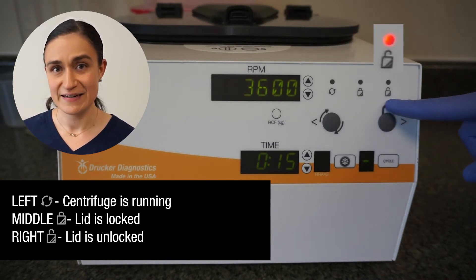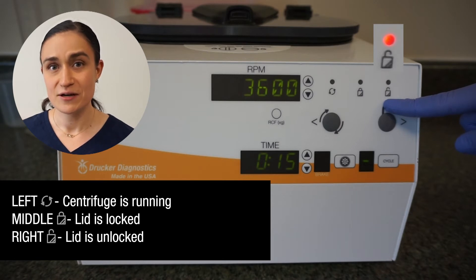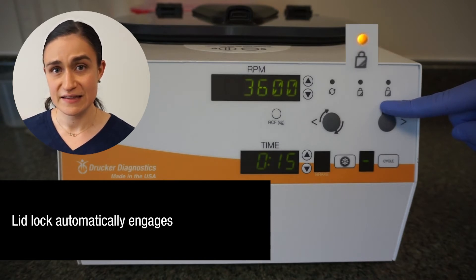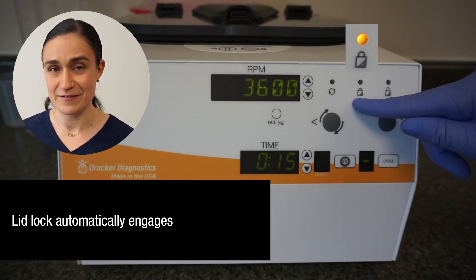The right-hand light — the unlock light — will illuminate after the centrifuge has come to a complete stop. The lid latch will disengage for 60 seconds, one minute, after the centrifuge has come to that complete stop. If the centrifuge is not opened during that time, the lid latch will lock in place again, and you'll need to use the stop unlock button — which we'll cover in just a moment — to unlock it and retrieve your samples.